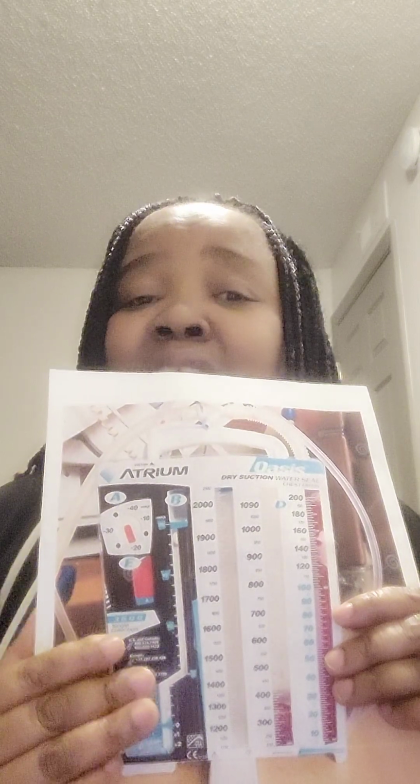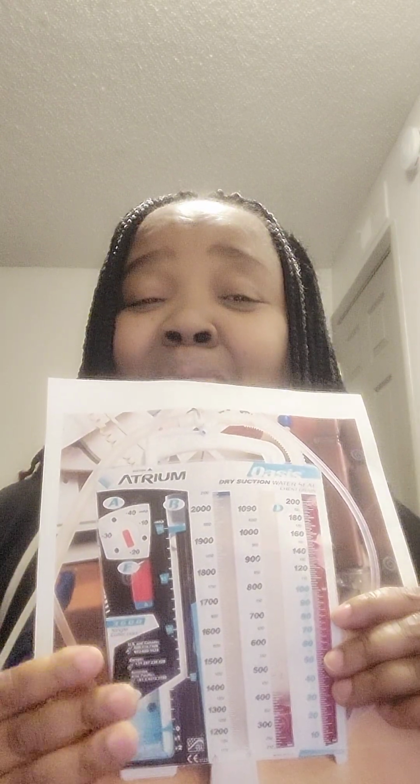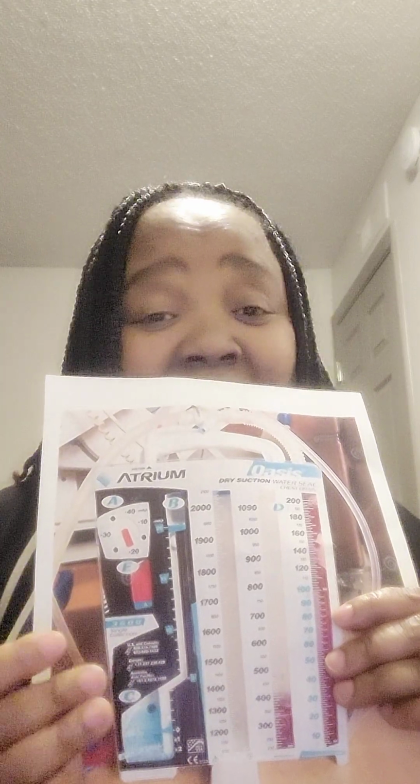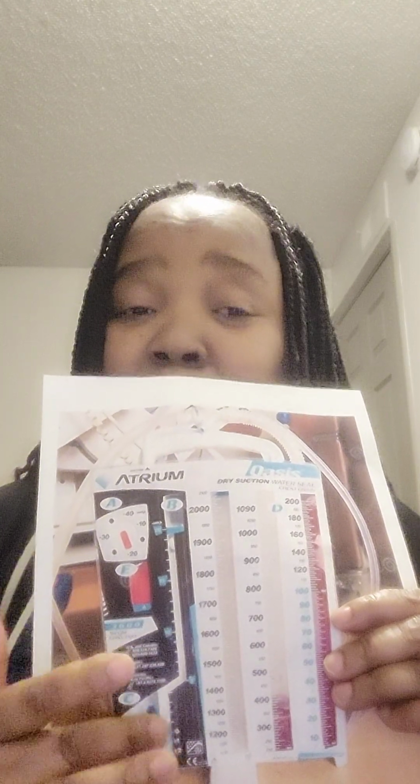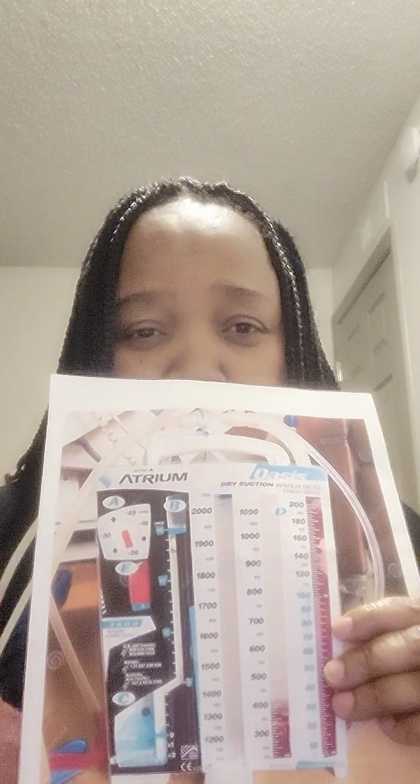But if it is not pneumothorax or it is at the end of treatment, the treatment should end between 2 to 3 days. At the end of 2 to 3 days, whether it's pneumothorax or whatever, there shouldn't be air, there shouldn't be anything happening here. If there is continuous or increased bubbling here after 2 or 3 days of treatment, whether pneumothorax or otherwise, you know that there is an air leak somewhere.